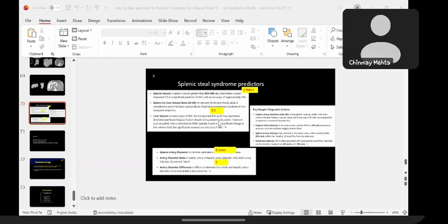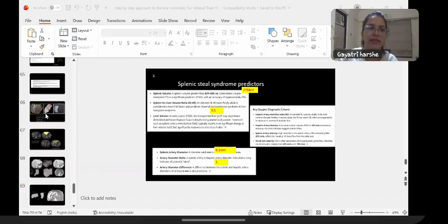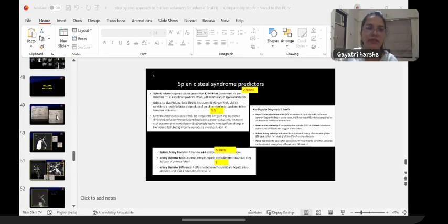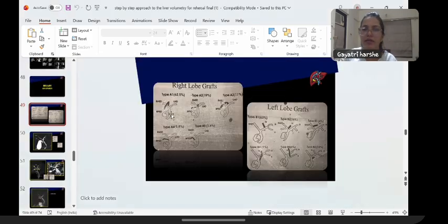The next question is about the types and how to decide about biliary anastomosis. Okay, so as I said, more than types, you need to describe the anatomy, and the main deciding factors will be the right posterior sectoral duct and the segment 4 duct.